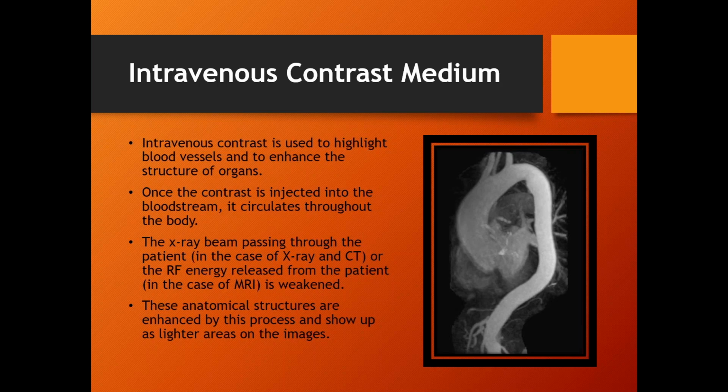Now, this bit right here, the X-ray, there are 3 different kinds of contrast injectors: CT, MRI, and angio. Now, 2 of them use X-rays to produce the images, CT and angio. The third one uses MRI, all right? So 2 different technologies are used by the 3 different kinds of injector model types.